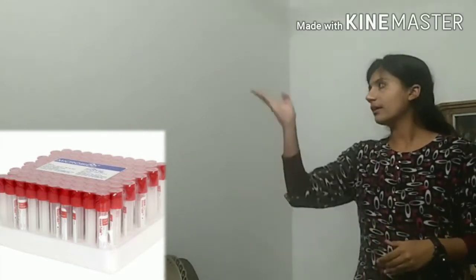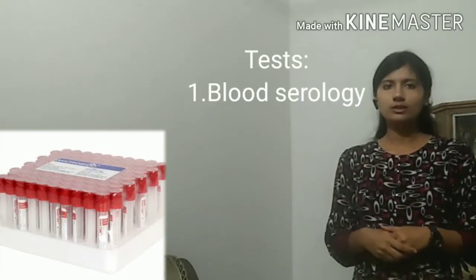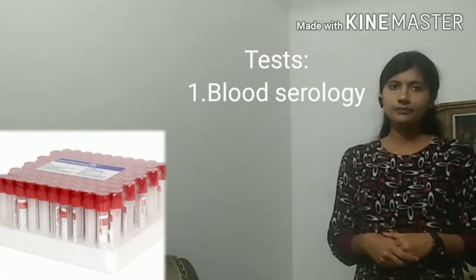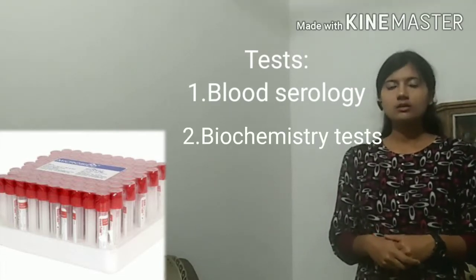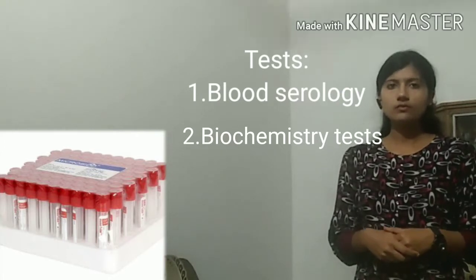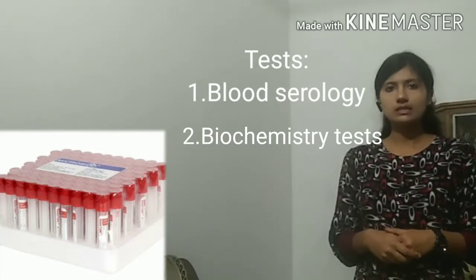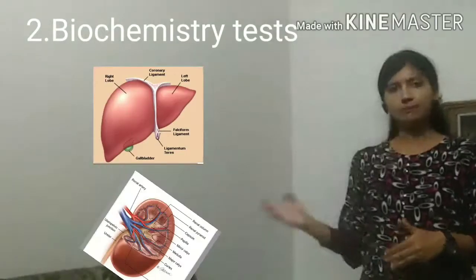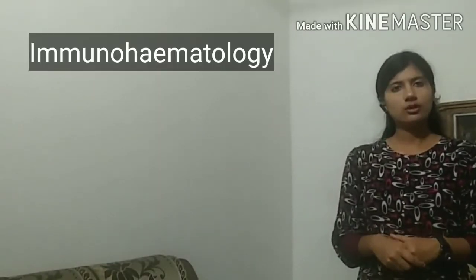It doesn't contain any anticoagulant in it. Sometimes this vial contains silica particles which act as a clot activator that will speed up clotting of blood. Uses of red vial. For example, blood serology, which includes tests that look for antibodies in the blood. Second, biochemistry tests. These are a series of blood tests used to evaluate the functional capacity of critical organ systems such as liver and kidney.